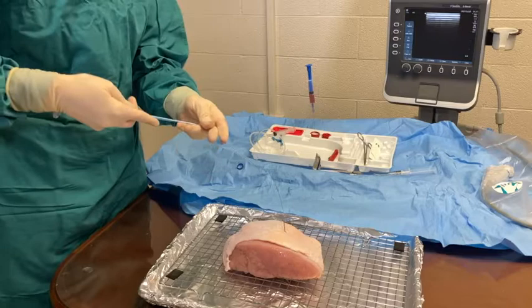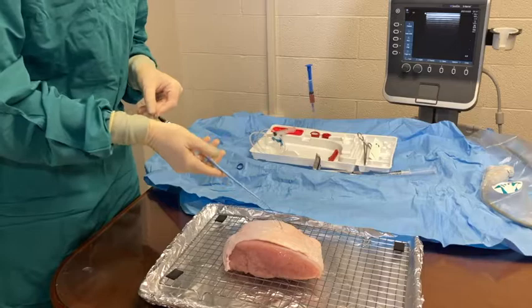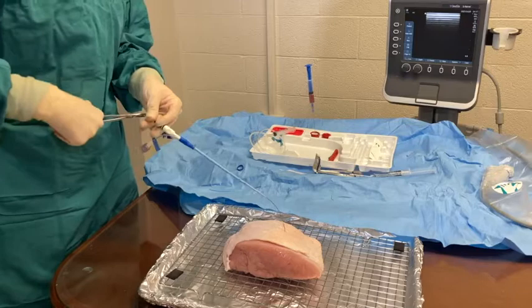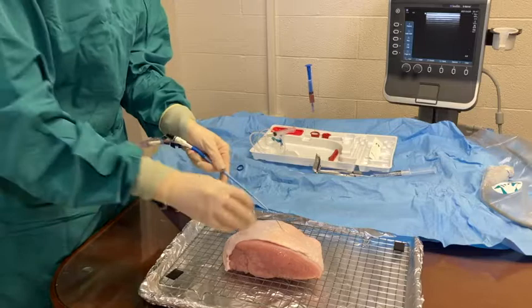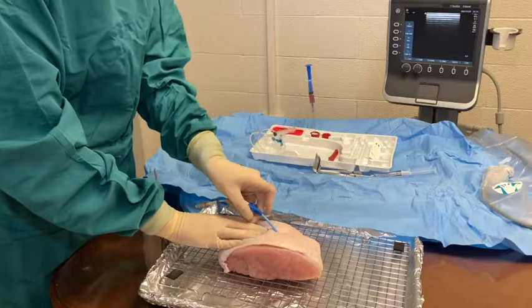Thread the dilator with the MAC introducer over the wire. Clip the forceps onto the wire to free your hands. Hold counter traction on the skin as you push the dilator with the MAC introducer through the skin as a whole.